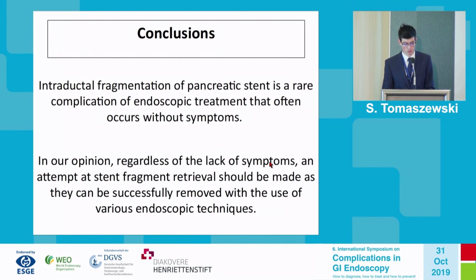So in conclusion, intraductal fragmentation of pancreatic stents is a rare complication of endoscopic treatment that often occurs without symptoms. In our opinion, regardless of the lack of symptoms, an attempt at stent fragment retrieval should be made, as they can be successfully removed with the use of endoscopic techniques.